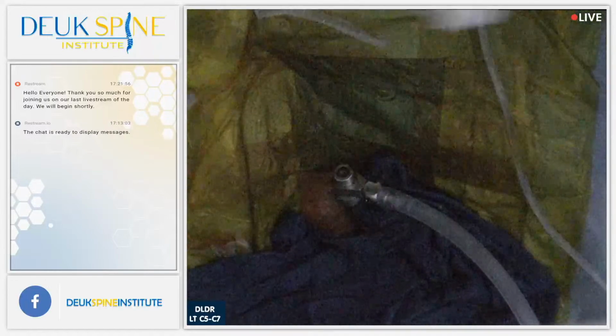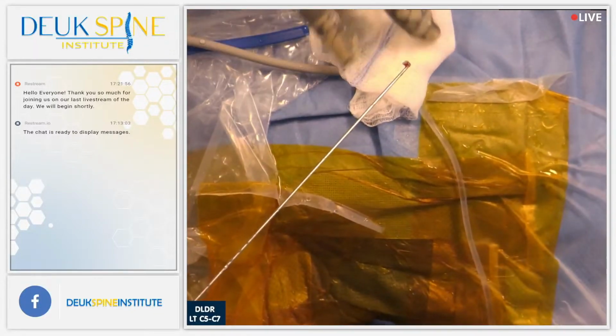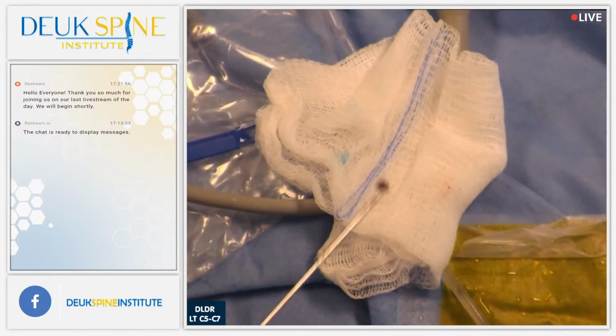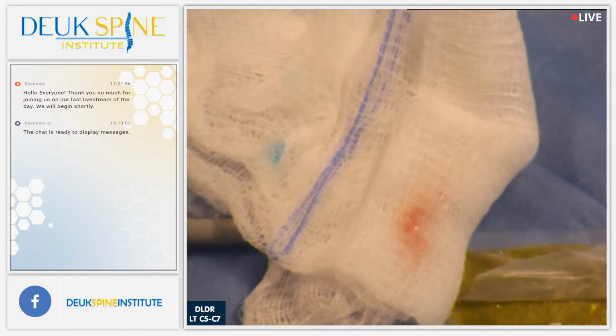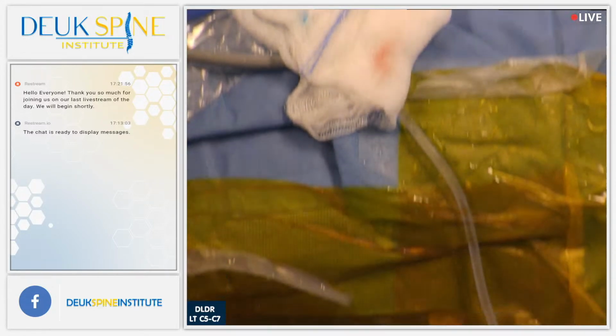Let's show this piece. Light on, please. Come on, Henry. Yeah, can you see this? Yes, we can. Bring the tape measure. Never mind. But you can see how big this thing is right there. Yes, we can. It's a big, big piece of herniation. Looks like a butterfly. Anyway, that's what we've been taking out, all these herniated fragments.